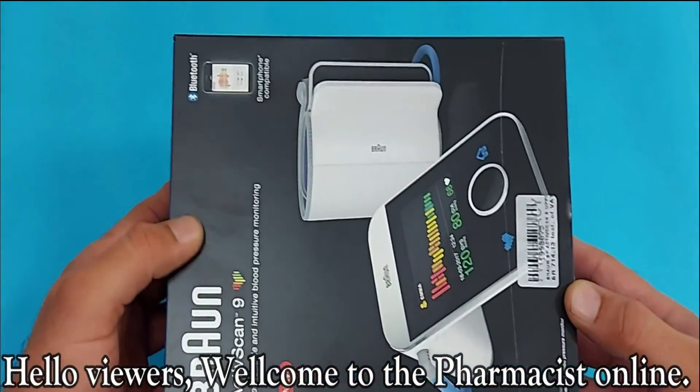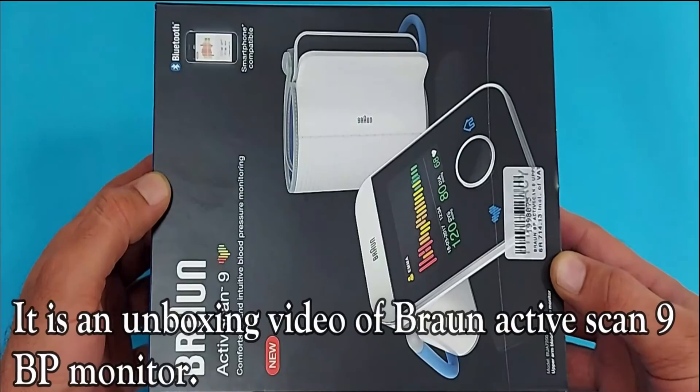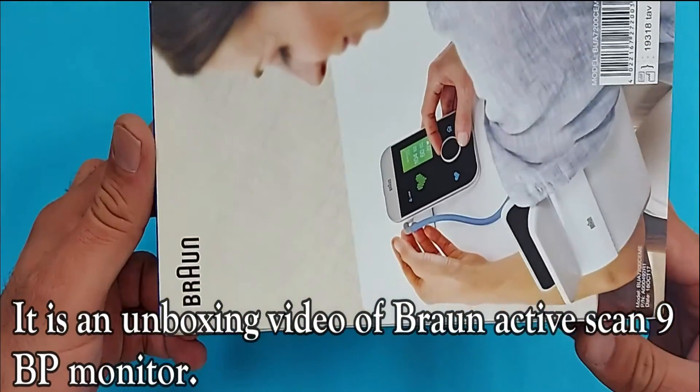Hello viewers! Welcome to the Pharmacist online. It is an unboxing video of Braun ActivScan 9 BP monitor.